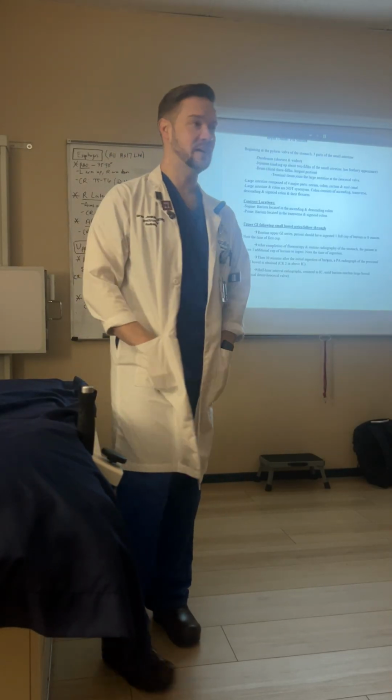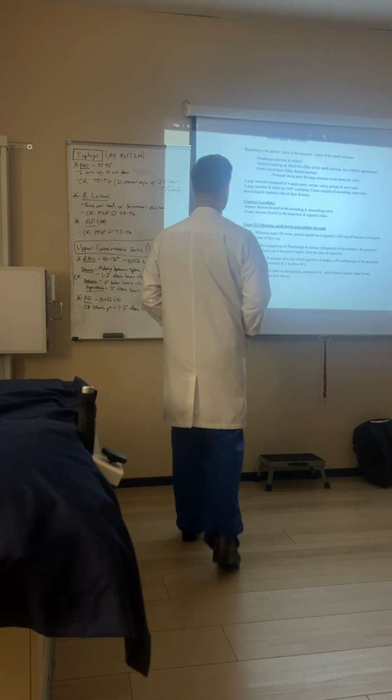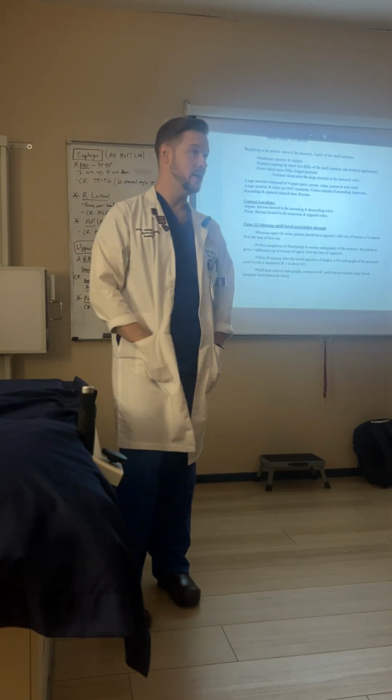Imaging of the GI tract today, and then we're going to follow that with our imaging of the GU today, okay? So as we discussed yesterday, three parts of the stomach: the fundus, the body, and the pylorus.